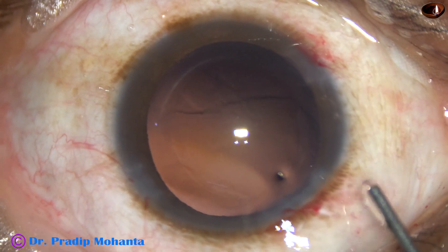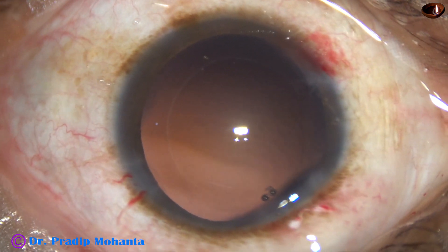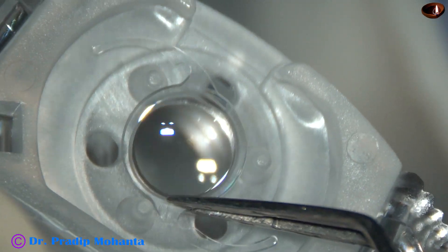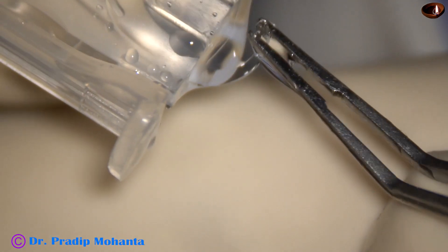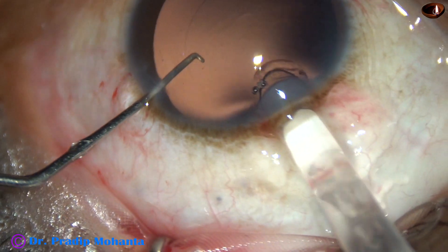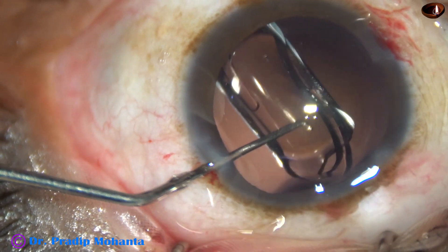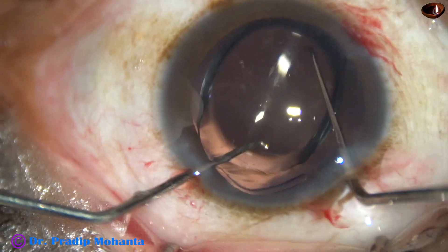And now 2% HPMC is injected again. It fills the capsular bag and the anterior chamber. This is the IHANS lens from G&J — this is the first IHANS lens I am going to implant. It is claimed to be a nice lens giving clear distant vision and good intermediate vision. The lens is placed in the capsular bag and rotated.